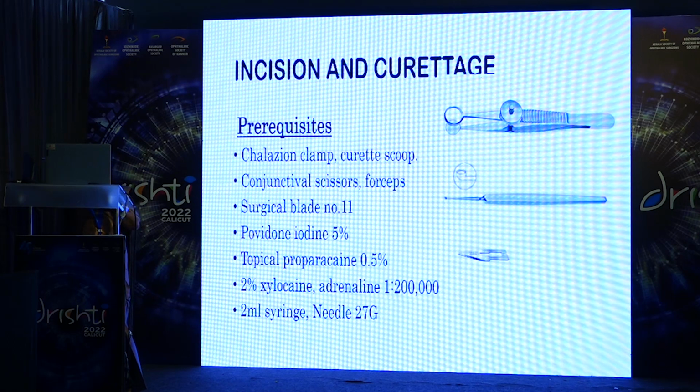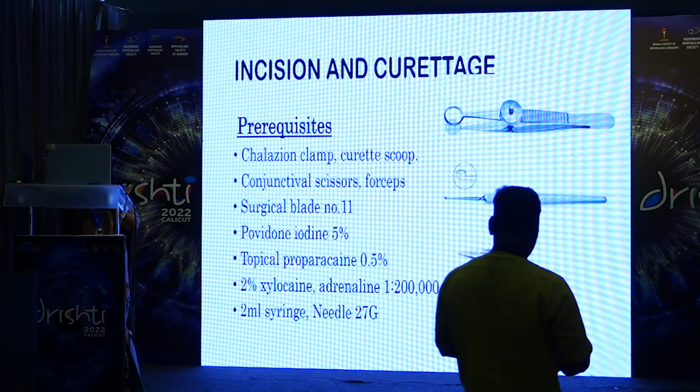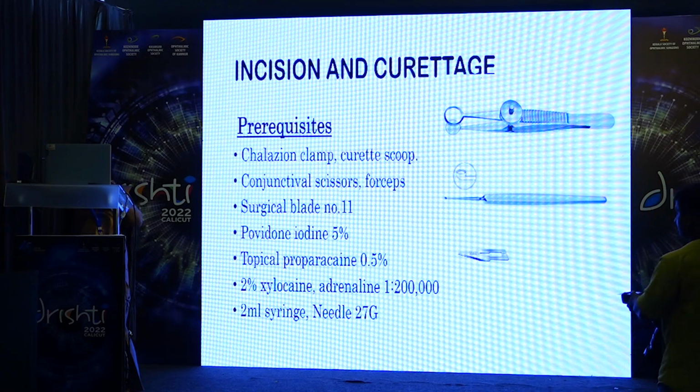So coming to the topic proper, the prerequisites for my procedure are chalazion clamp, curette, conjunctival scissors and forceps, and number 11 blade, and other things like topical anesthetics and lignocaine, adrenaline, etc.